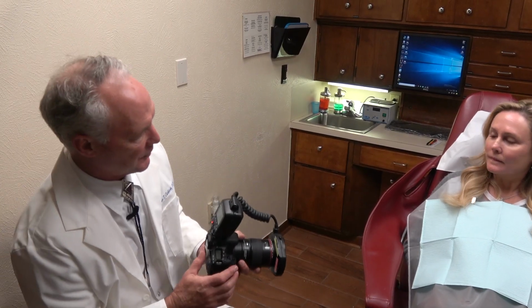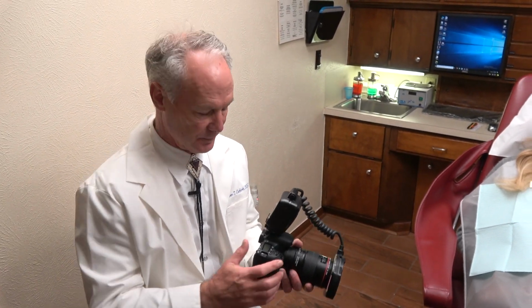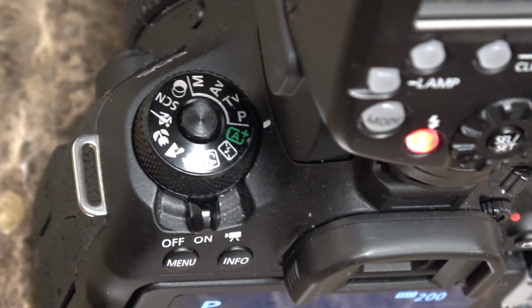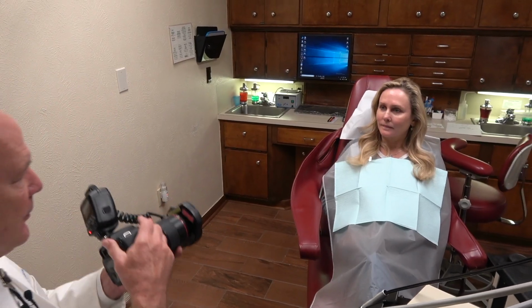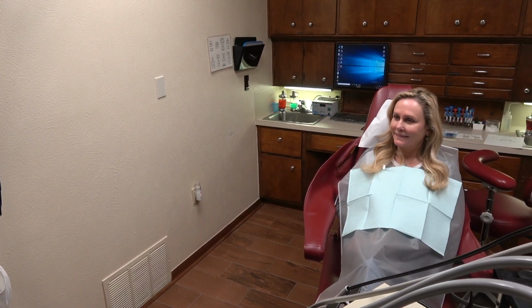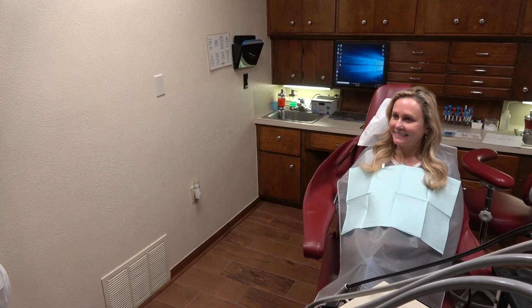Okay, let's take some photos. And these are the photos I take of every new patient prior to their consultation. So I'm setting this on AF and this button right here on P, and this is going to be a full face. Would you say a big cheese, please? Beautiful.